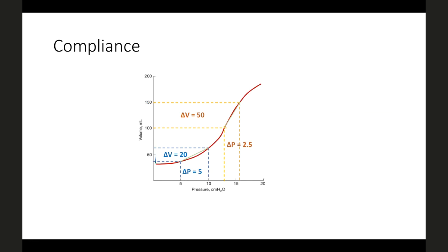You can remember the analogy of a balloon. Initially you can inflate it, after a small resistance you can inflate it better. After a particular point, the more you exert pressure, the change in volume is not that much, because it will go to something like a plateau.